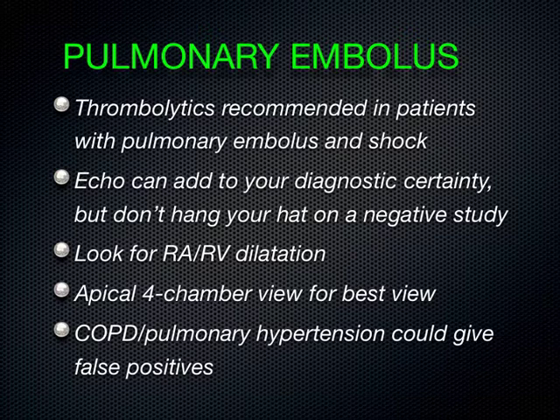We don't get a lot of patients with COPD at UC Irvine for whatever reason compared to other places where I've worked. Maybe there's just fewer smokers around Orange County than in other centers. I'm not really sure. But lucky for us with doing ultrasound of the heart, we don't have that confounder too much. But in the setting of COPD or pulmonary hypertension, you have to be very careful how you interpret anything with echo.